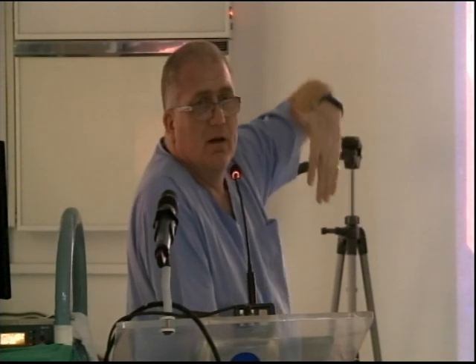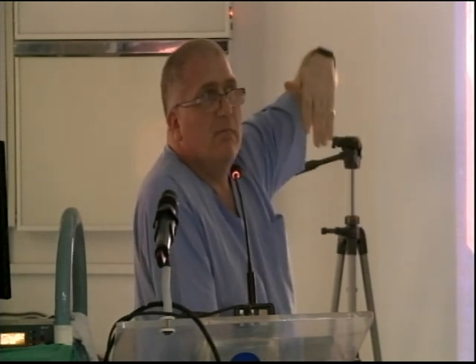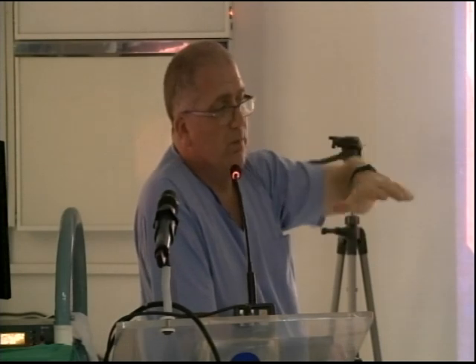Endoloop has a lot of complications. Endoloop is actually, when it goes in, it shapes like a boat, like a leaf. And when it comes in, this tail sticks up and it gets in the way. Injection? What do you inject? Where? Why? Okay, if I was to say to you, stick the adrenaline in the head, what do you think that's going to do? Instead of the base, stick it in the head.